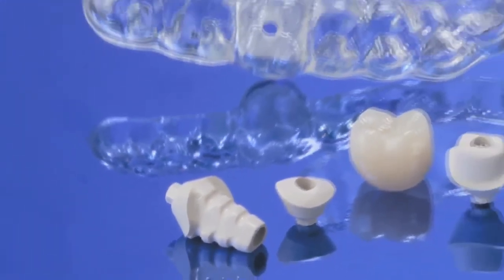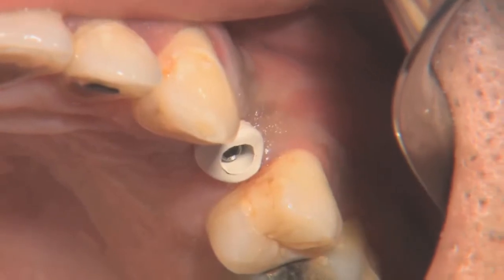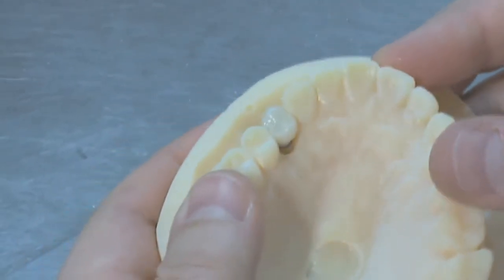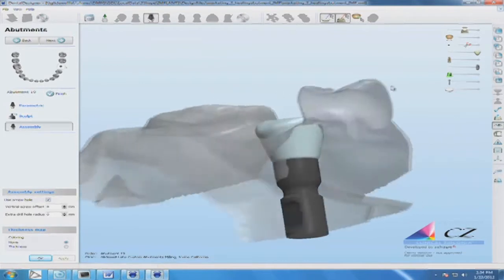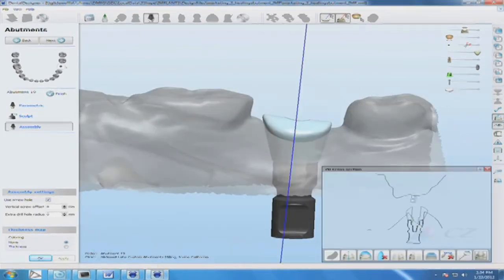This technique allows the tissue to heal properly in the best possible position. The patient and dentist can start to visualize the emergence profile of the transitional restorations. And then the laboratory technician can ultimately understand tissue health, contours, and ideal aesthetics.